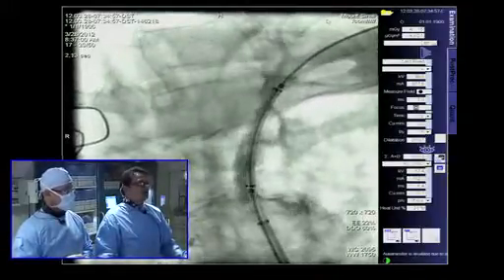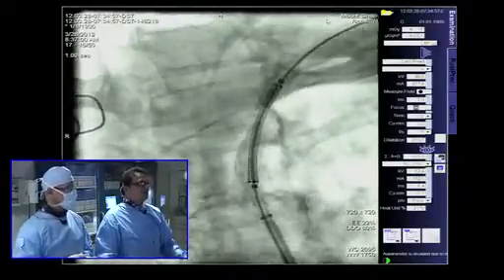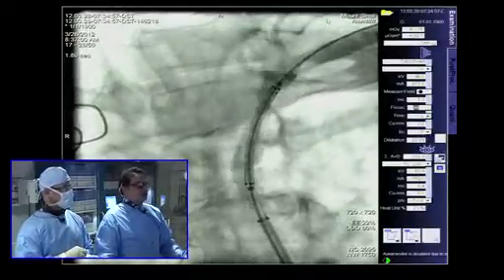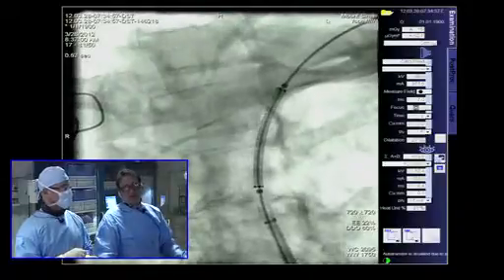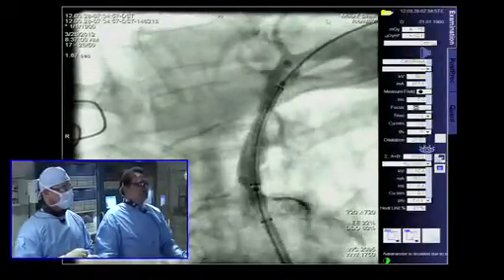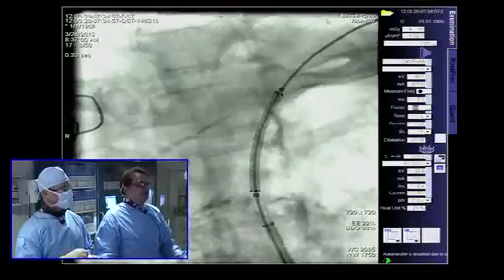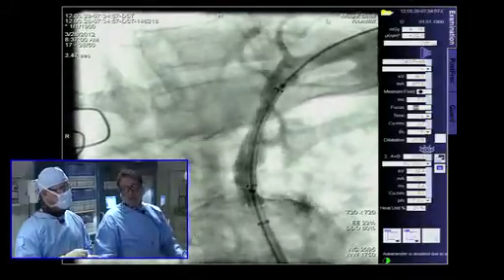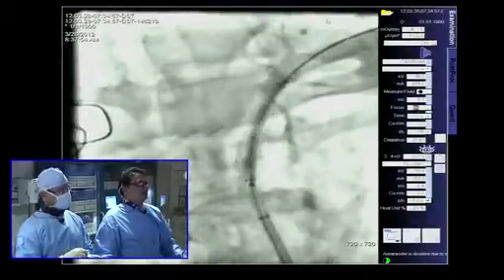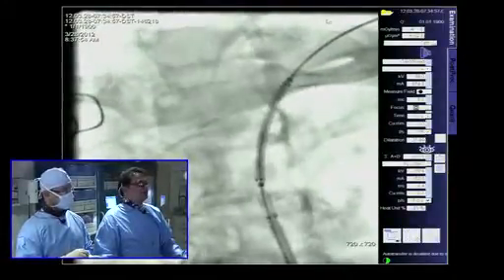It's not an aorta-ostial lesion. I think that will be more than appropriate. Some would argue that all subclavians are aorta-ostial lesions, but I think here, because we have a CAT scan showing there's absolutely no aorta-ostial stenosis, and we have obviously gradients showing that, and now we have a stent in place already, we're going to go ahead and have Ray just give us a little test, okay? And then we're very happy with our placement, okay?